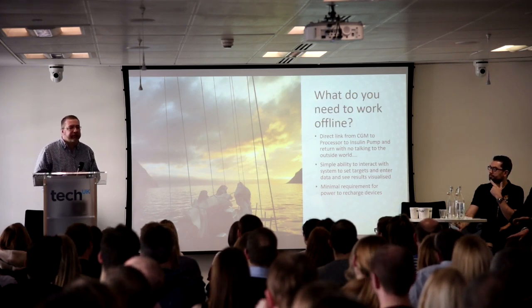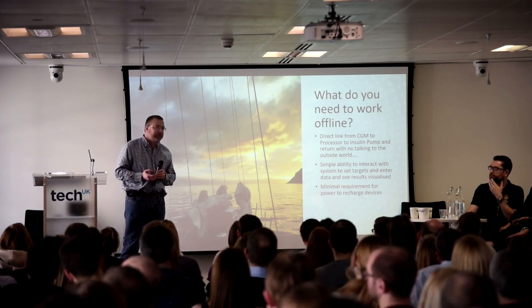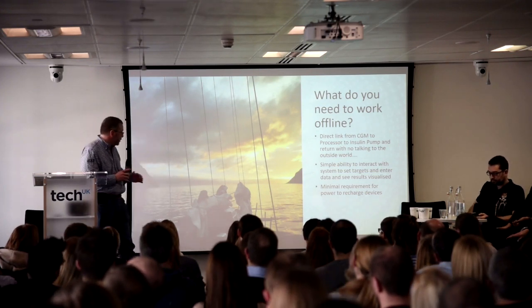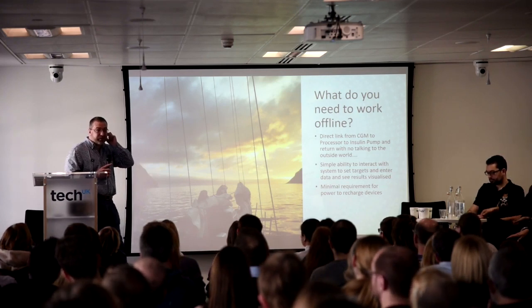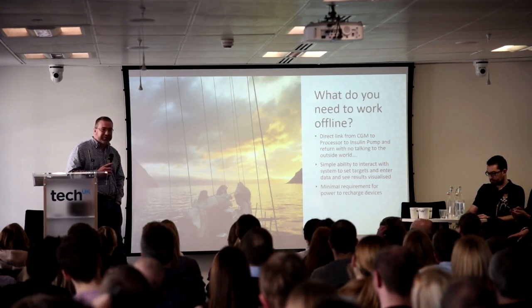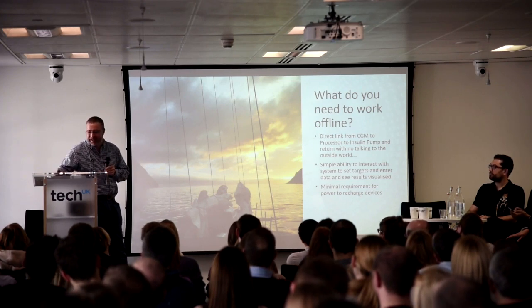You've got to have a simple way of interacting with the system to set those temporary targets, or to look at data, or to see the results. And really, if you're somewhere like this, you want to have a minimum requirement for power, because it's not so easy to get to a USB outlet to charge up a phone, a Riley Link, a CGM receiver, or anything else you're carrying at the time. Low power requirements are the key aspect of this.